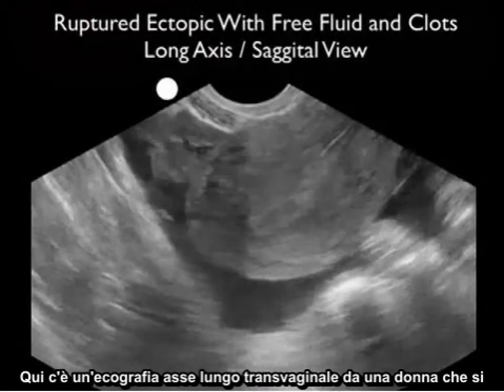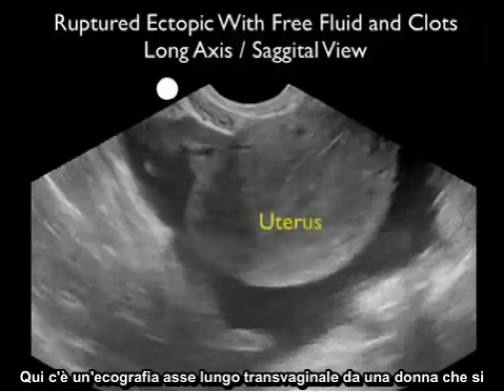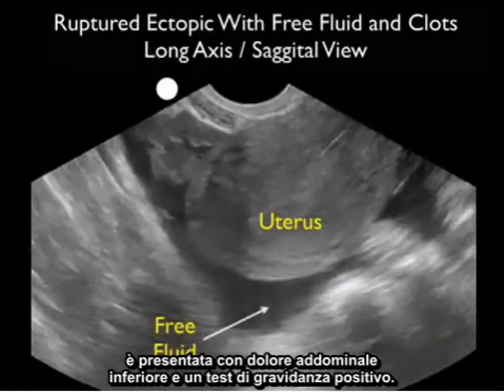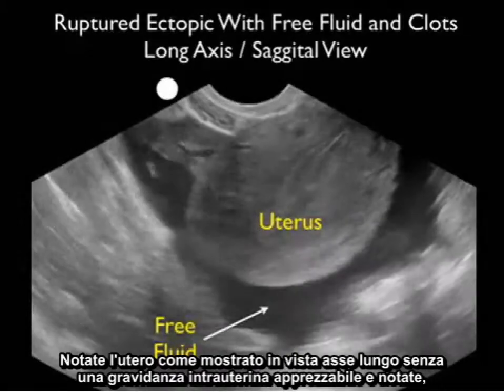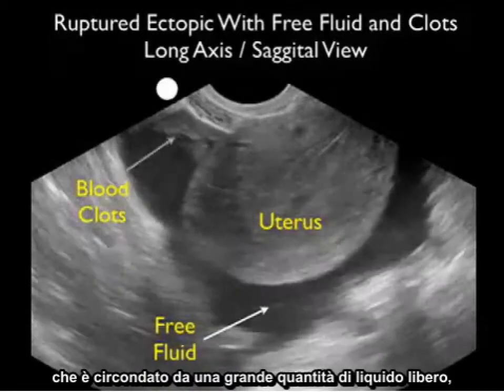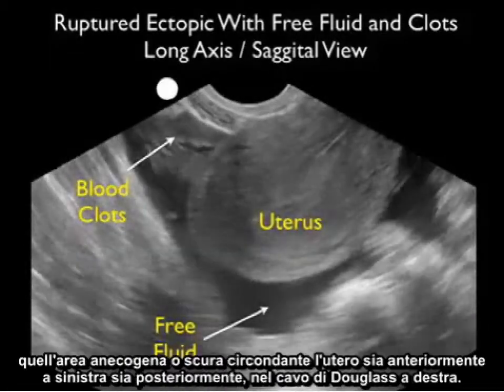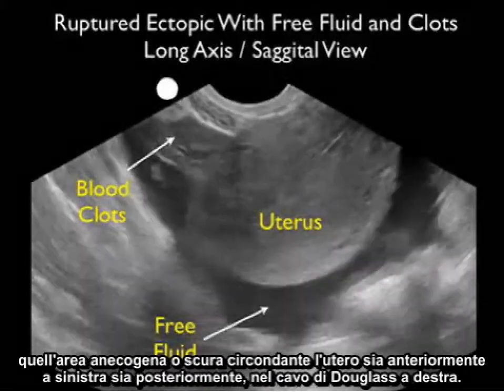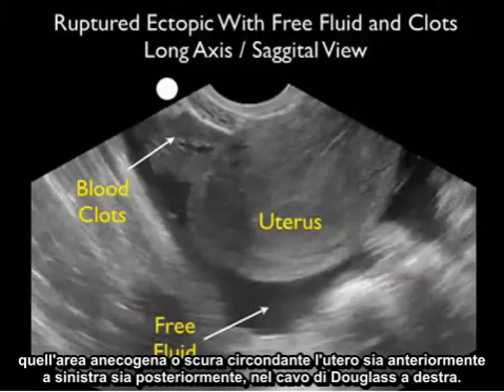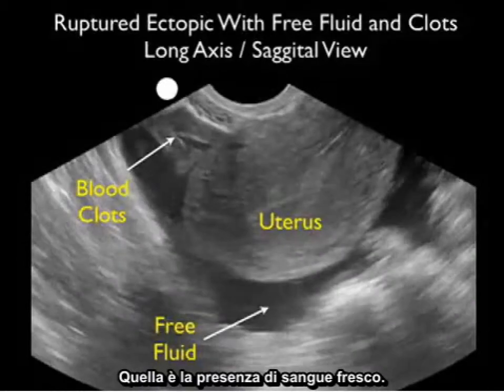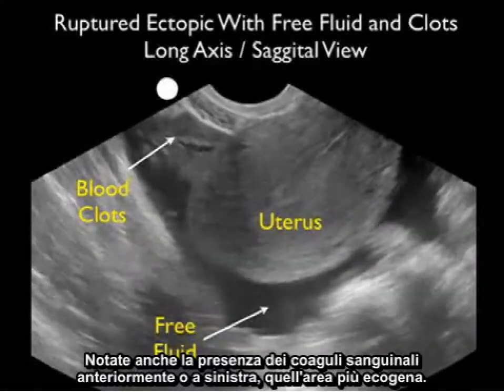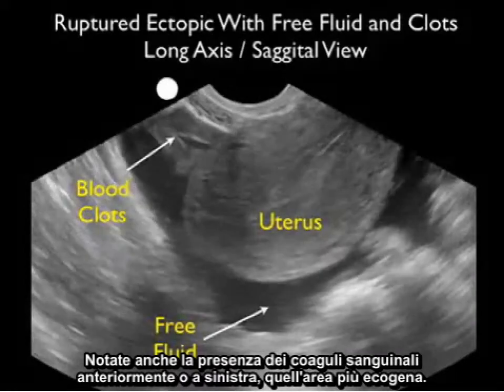Here's a transvaginal long axis ultrasound from a woman who presented with lower abdominal pain and a positive pregnancy test. Notice the uterus in long axis view without an appreciable intrauterine pregnancy, surrounded by a large amount of free fluid — that dark or anechoic area surrounding the uterus both anteriorly to the left and posteriorly in the cul-de-sac to the right. That is the presence of fresh blood. Notice also the presence of blood clots anteriorly, that more echogenic area.